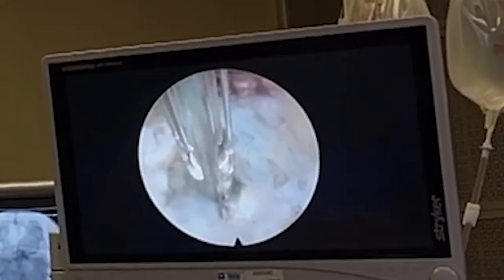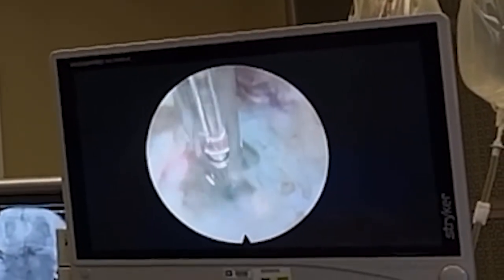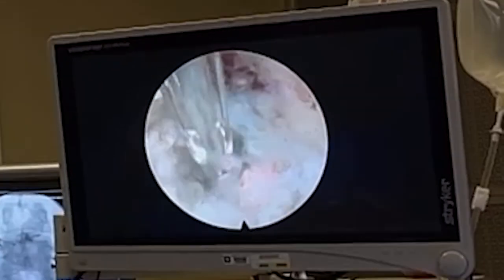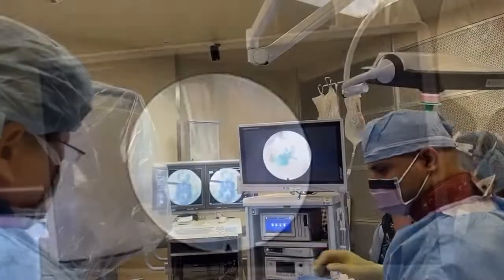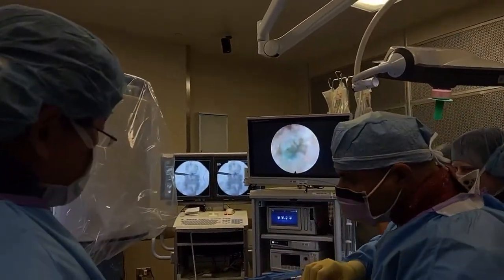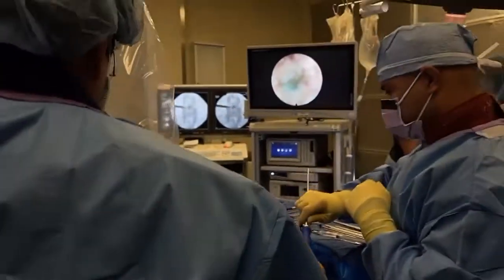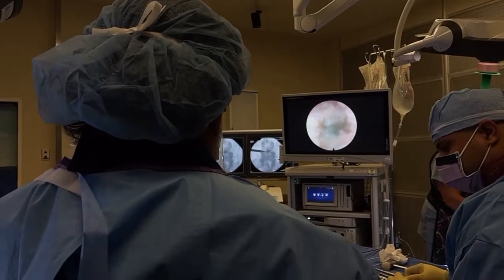And look at the blue right there, more and more medial. It's so awesome when everything lines up clinically. Bone spur. So all the instruments articulate, look at that, because they have to go down a really narrow corridor. So I've got all these curved, specialized instruments that are really tedious and annoying to use.